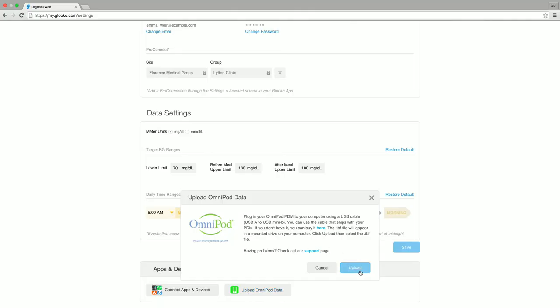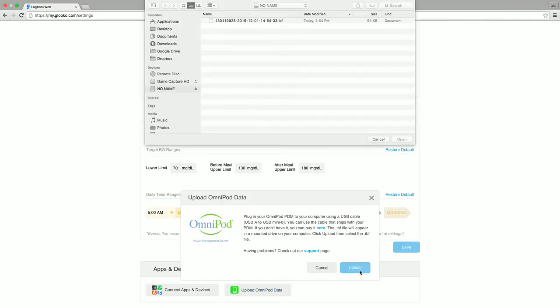Click the upload button. Either Finder on a Mac or Windows Explorer on PC will open to the available devices on your machine. From here, you'll select the Omnipod device, usually labeled as no name.